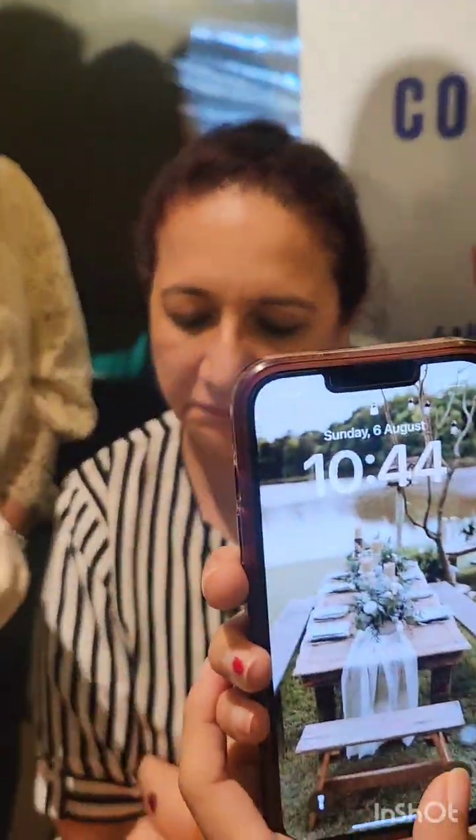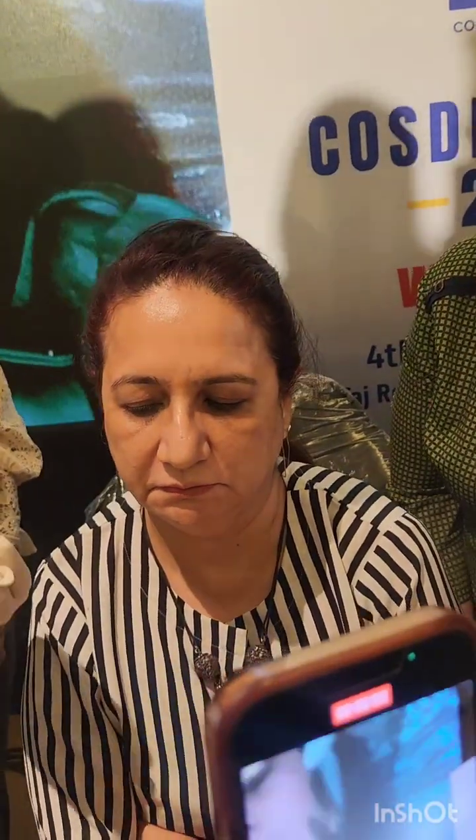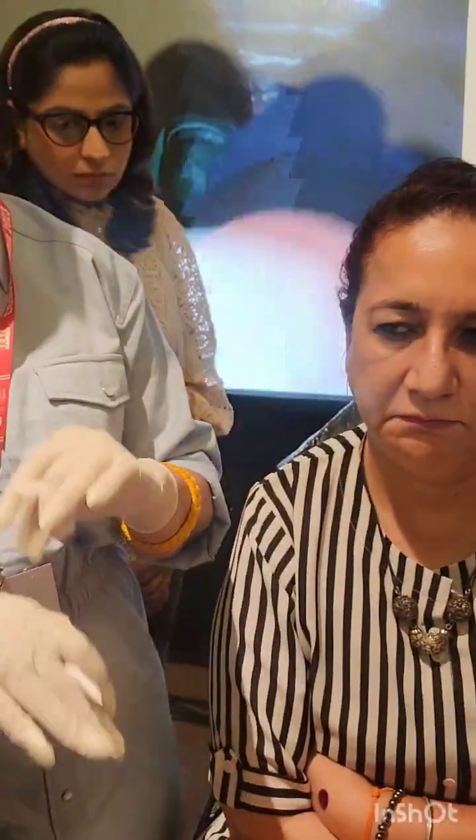Now to the marking, never do it from the sideways, okay? Because that is the main reason behind giving asymmetry. Because face is already asymmetric.